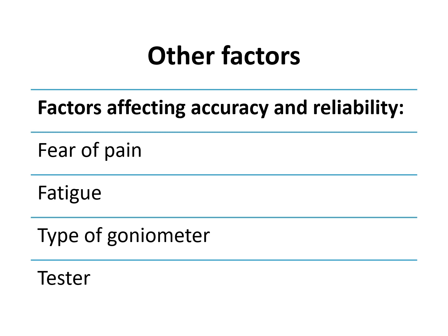So again, I'm telling you this is a practical technique. You need to practice many times before you actually do it on a patient, because if you are not trained enough, the accuracy and reliability of the results will be poor. If the tester is trained enough, the readings will be much more accurate and reliable. So these are the factors on which the accuracy and reliability of your readings can depend.